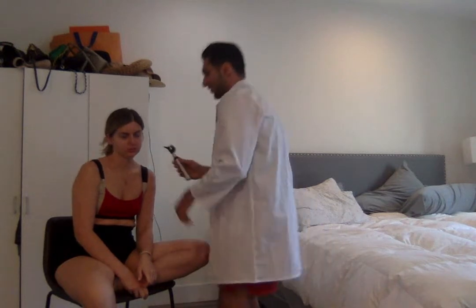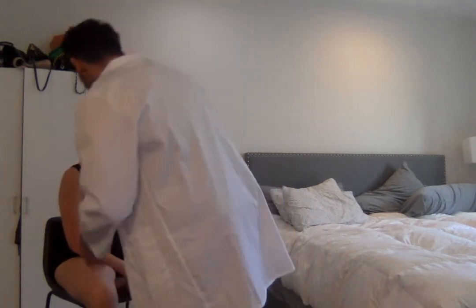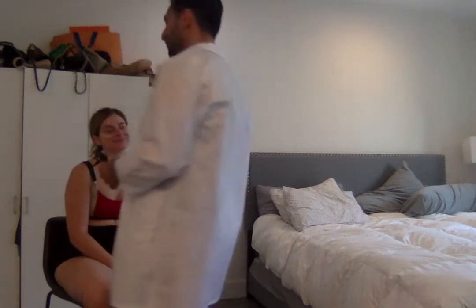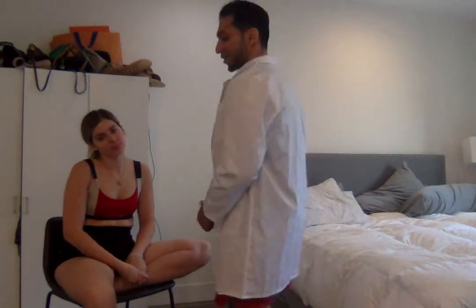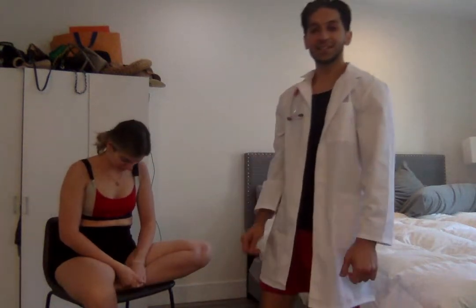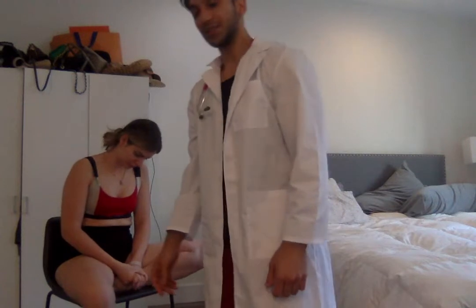Okay, so this is normal. So my findings for the ears on the left side: we have the cone of light at 7 o'clock. Tympanic membrane is pearly and gray.